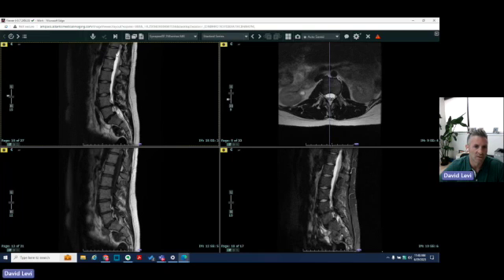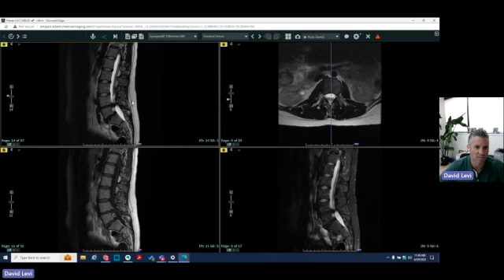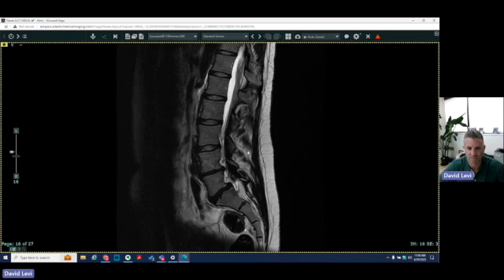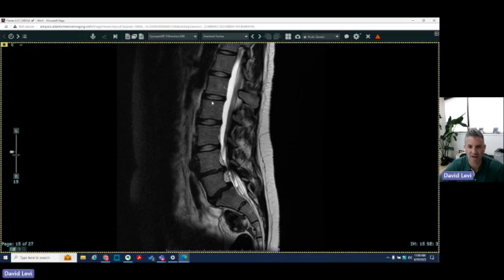This direction is towards the patient's head, and this is towards the patient's feet — this is the lumbar spine. These are the lumbar vertebral bodies. There are five lumbar vertebral bodies: L1, L2, L3, L4, and L5.